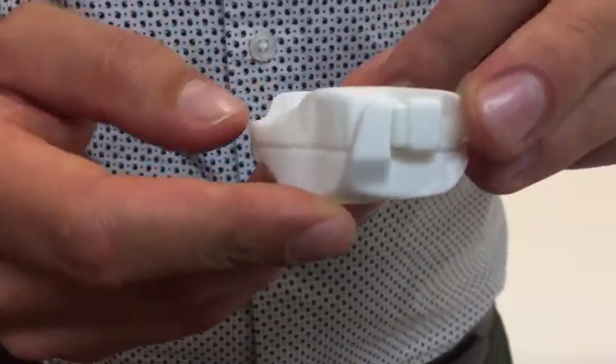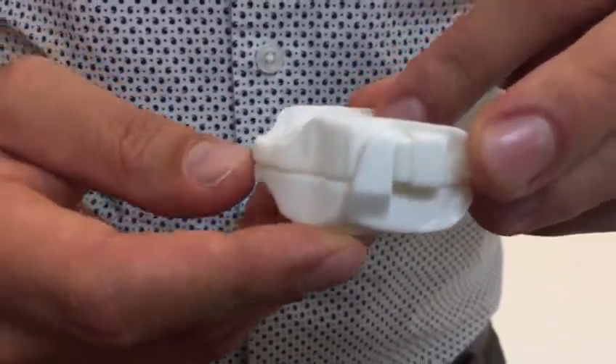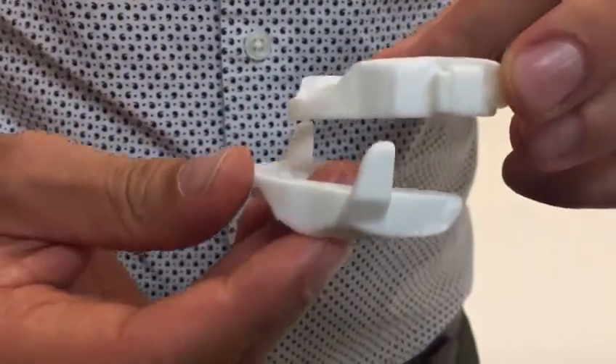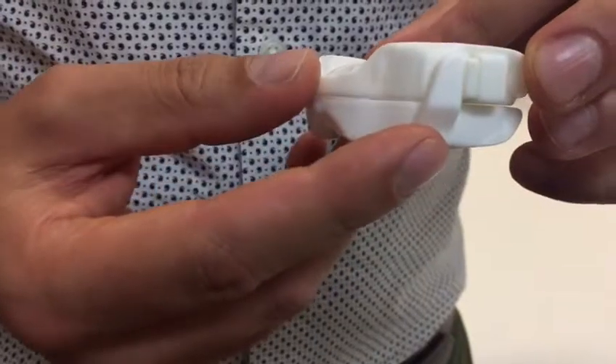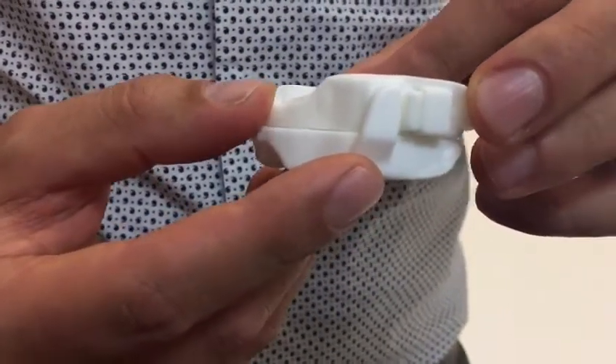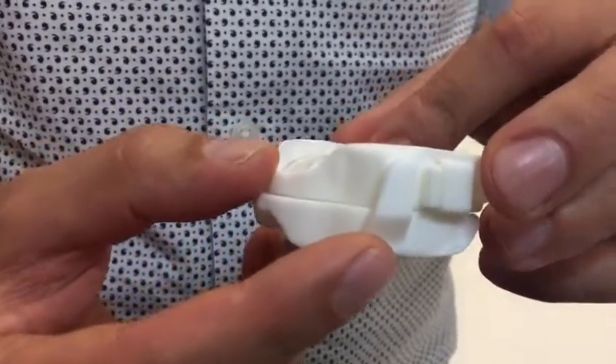This is the Dorsal appliance, which is one of the main appliances that we use at Sleepwise. It's the only appliance where the upper and lower parts are not connected. The wings that you can see here on the sides hold the lower jaw forwards overnight, and that keeps the airway open and limits snoring and the risk of apnea.